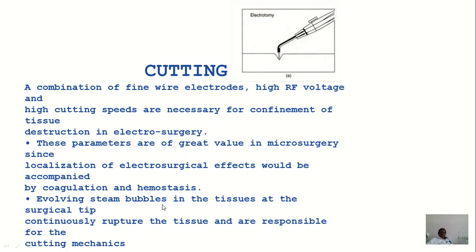Evolving steam bubbles, because the heat boils the tissue fluid, in the tissues at the surgical tip continuously rupture the tissue and are responsible for the cutting mechanism.